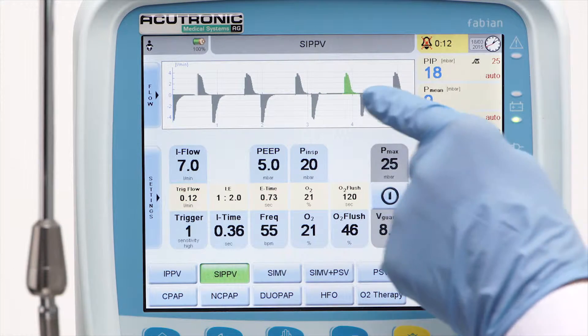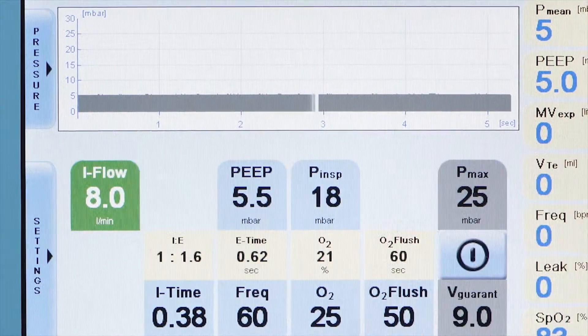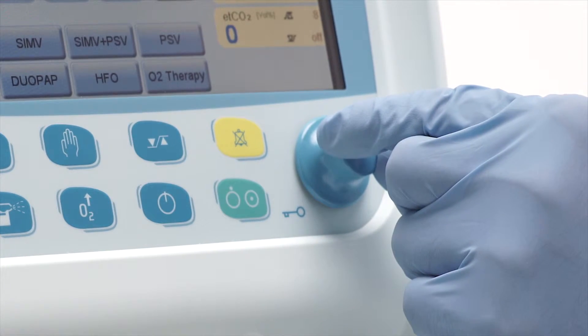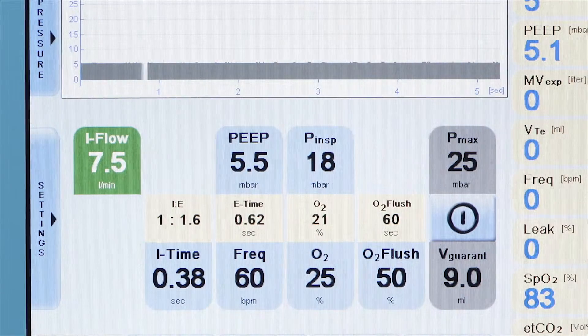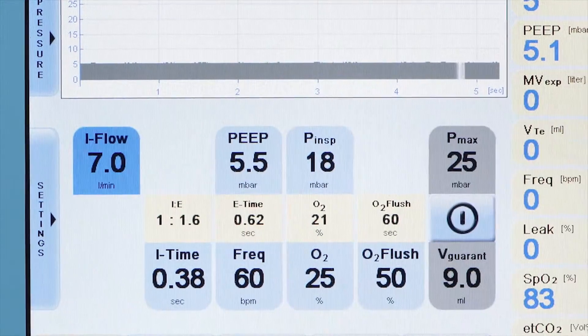The following parameters should be set. iFlow. This should be set according to patient needs. This flow controls the pressure rise time of the inspiration. If set too low, the P-INSP is reached more slowly.